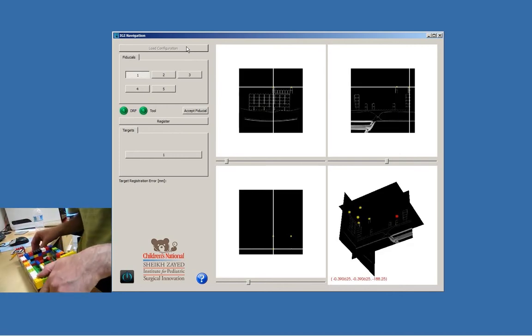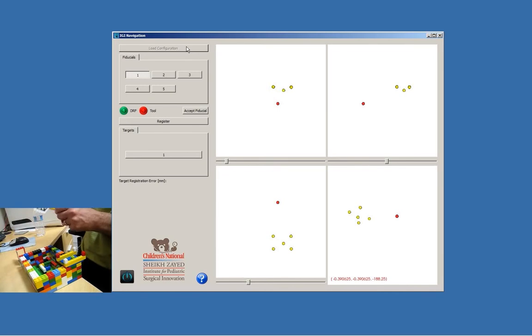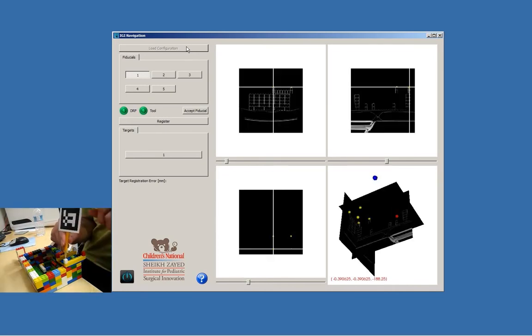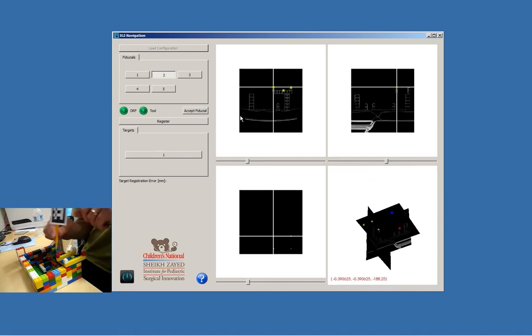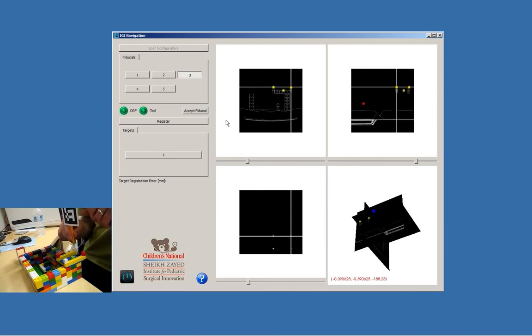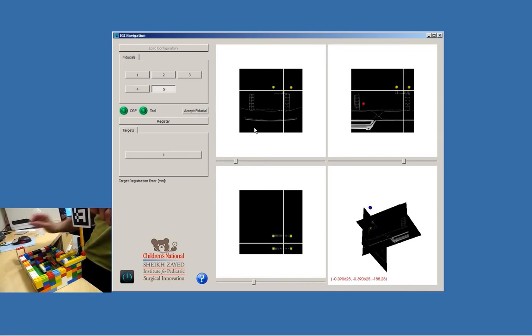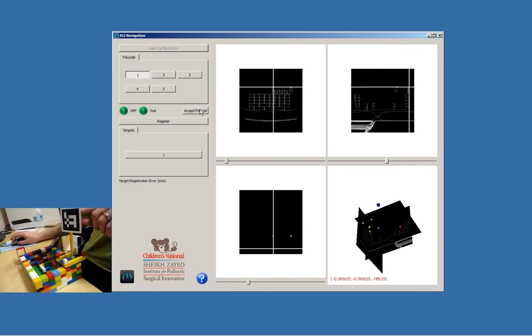Let's position our patient. The first thing that we need to do is register. We have our fiducials and accept the first fiducial, second, third, fourth, and fifth. Now we can register, and as you can see here this is the tip of our pointer.